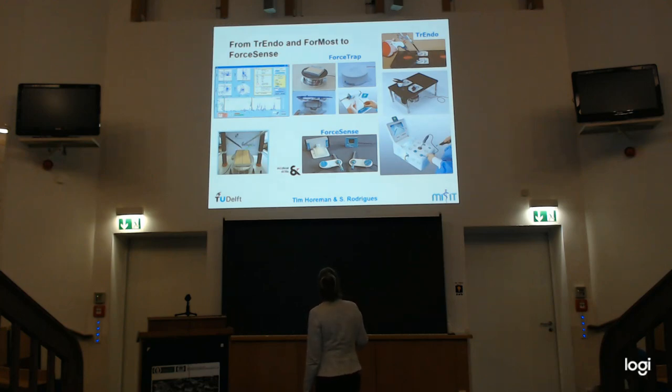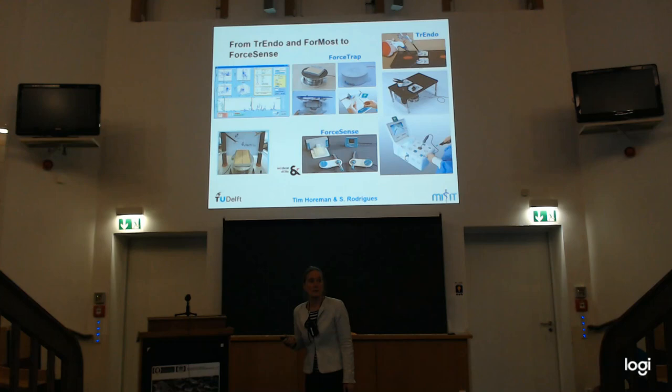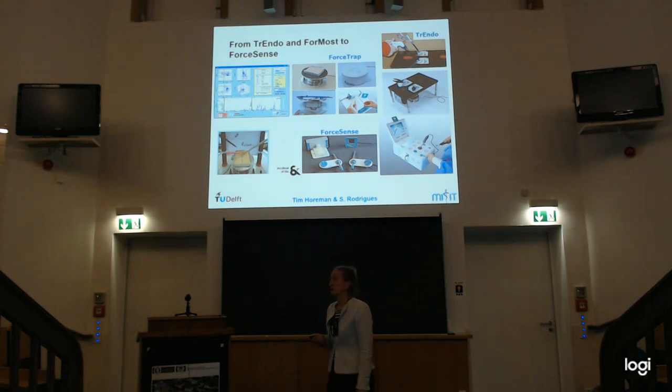Next we also developed a force platform, and we also started with existing consumer products as an interface to make a force platform out of this. Again we try to make it as affordable as possible. And now it's a product that you can add on to all kinds of box frames. And this one is now, for example, an add-on supported by an American company that sells it in combination with their own box frames.